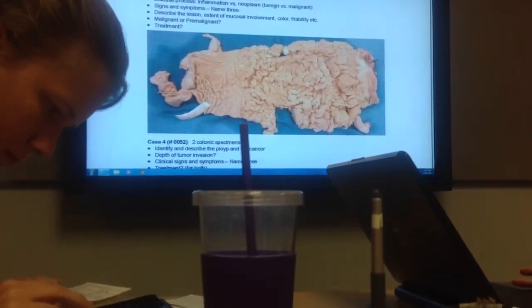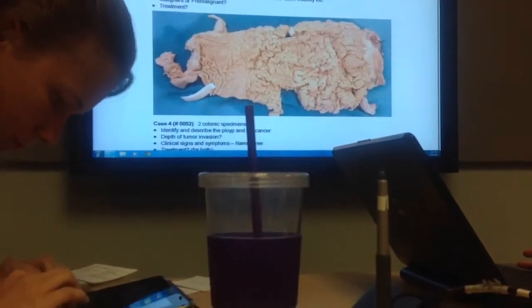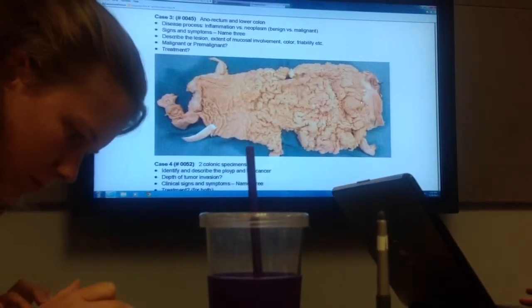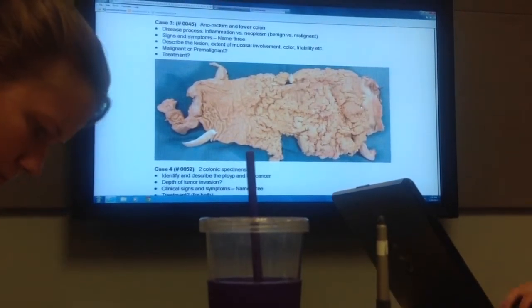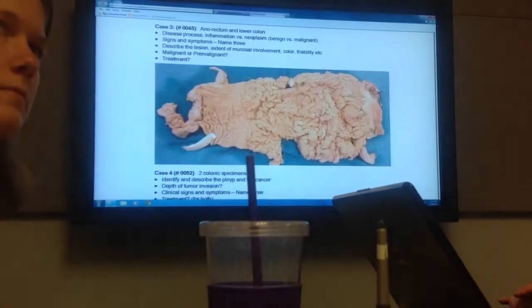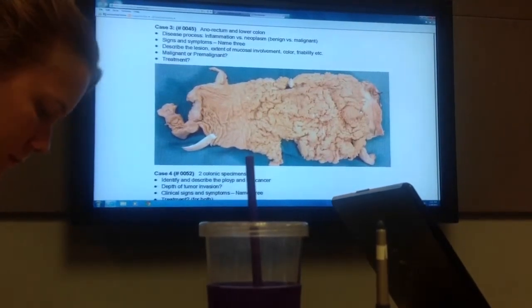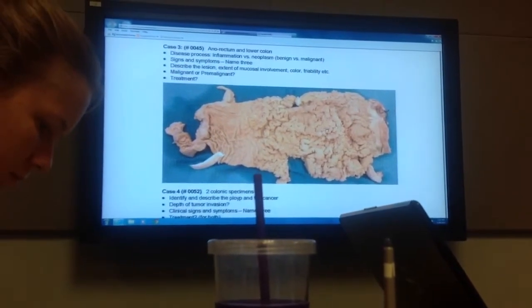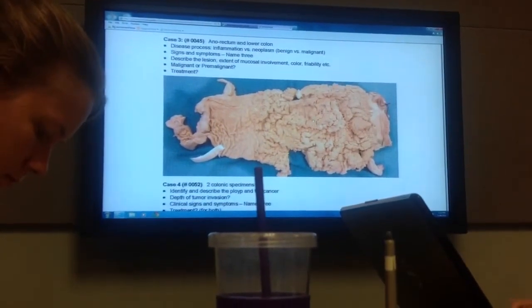Okay, so I will tell you some things on my notes. They say it's shaggy. Okay, so yeah, I can buy that. This one was actually over 5 centimeters in diameter. That's pretty bad. And then they agree that there's probably a concurrent carcinoma in here somewhere, just based on the fact that it's a villous lesion of this huge size.